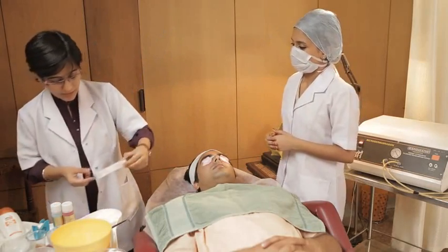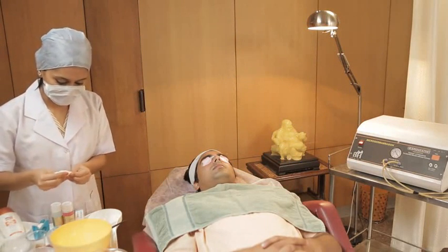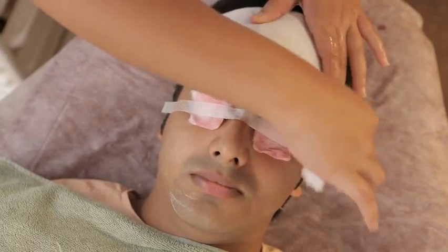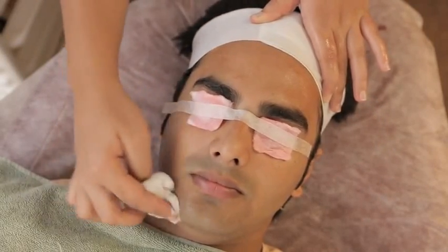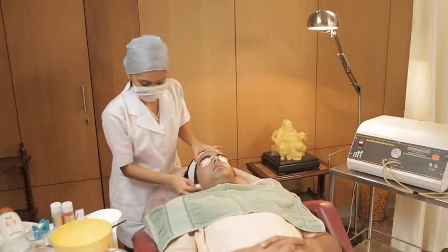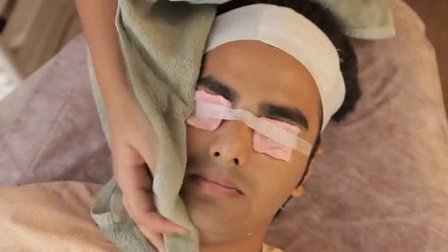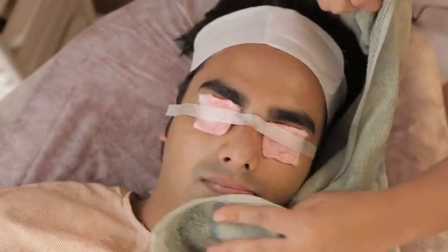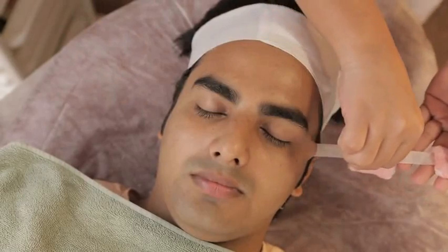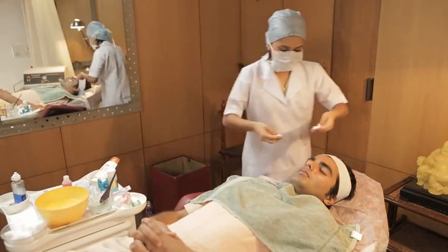And you can use this medicinal cream if required. Of course ma'am. Sir, I'll just clean your face with wet cotton. I'm removing the eye pads — please keep your eyes closed.